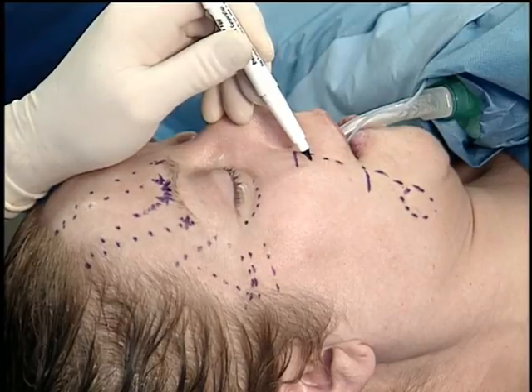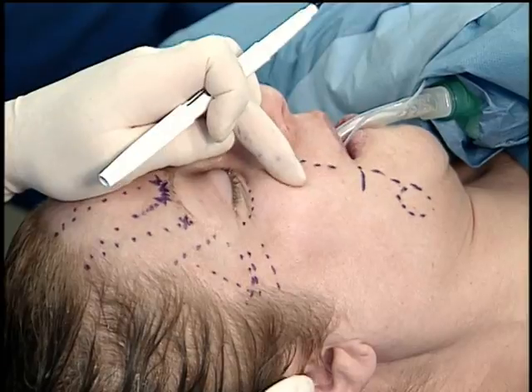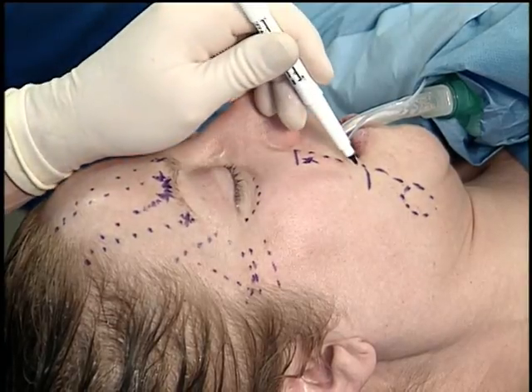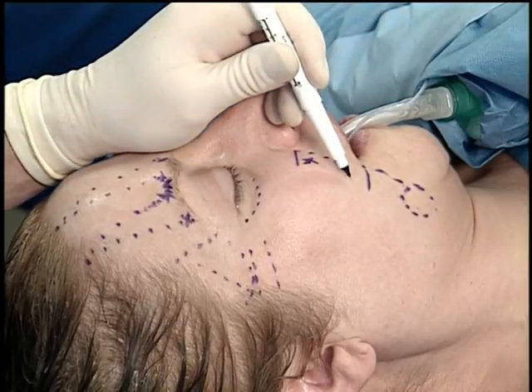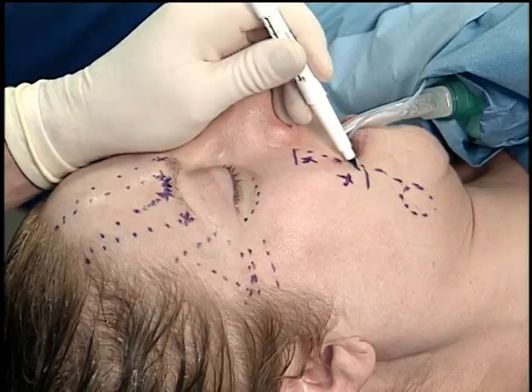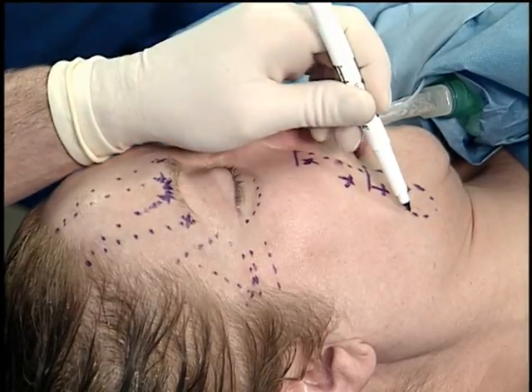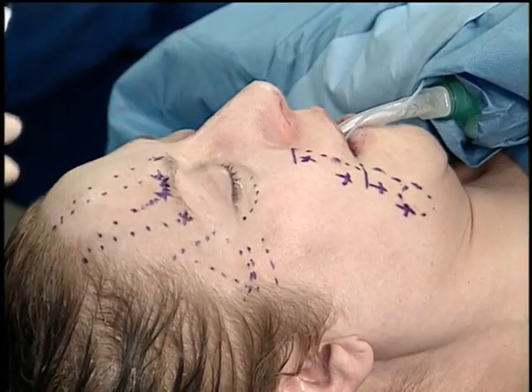I want to get the upper part of the malar fat pad elevated right here. This part of the malar fat pad elevated. So I exit half an inch lateral to the nasolabial line at about the alar base. Come down to just above the commissure. There's the lower part of the malar fat pad. I'm going to exit just above the commissure, and about half an inch to an inch lateral to the nasolabial line. Below the commissure, I want to pull directly on the labiomental line, just below the commissure, and directly on the jowl. So those are the 4 common exit ports that I then have.